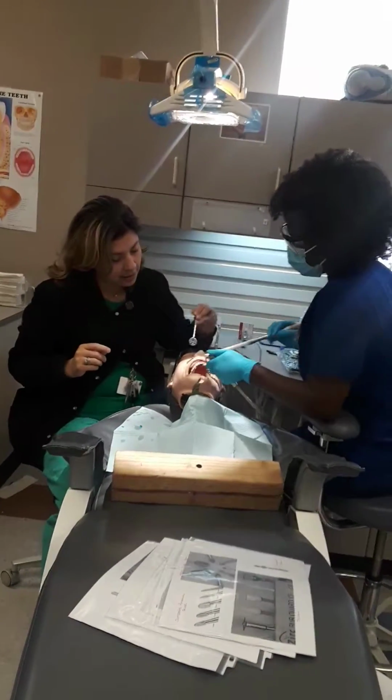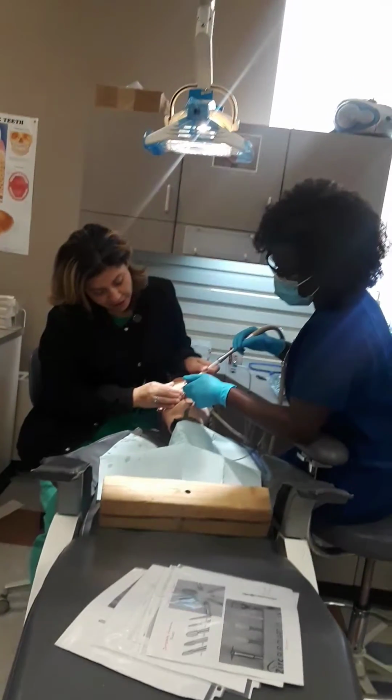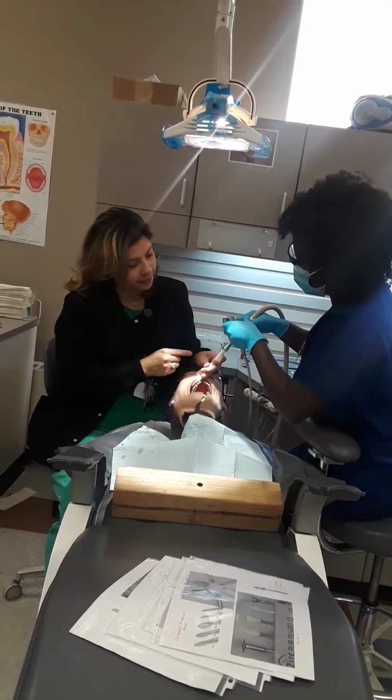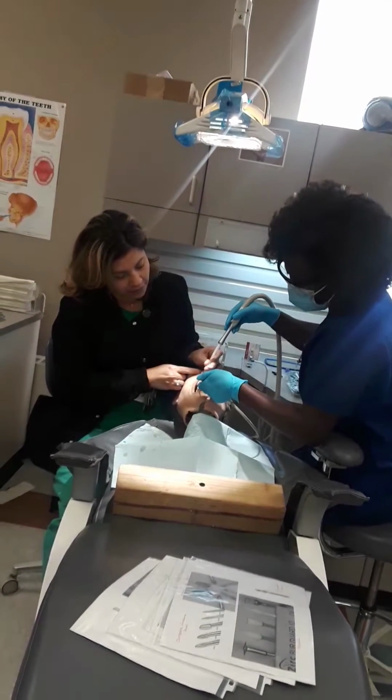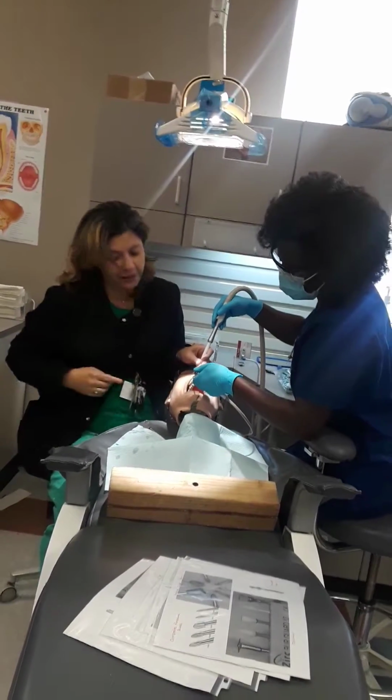Should I have one from up here? Yeah, so another thing, you want to hover, so you want this up here like she's doing, and then if you spray, it will go directly in there. There you go. Perfect.